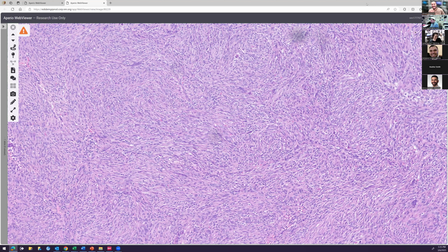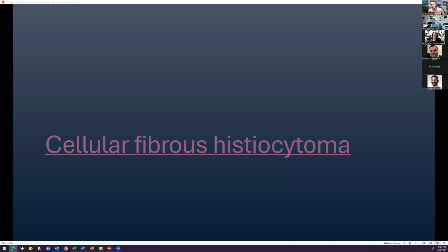But anyways, for deep fibrous histiocytoma, is it just a dermatofibroma that is deep? Yeah, so deep down into generally the subcutis. You'll see a little well-circumscribed ball of FH down below. All right, perfect. That is that one. Let me see what our next slide is here.